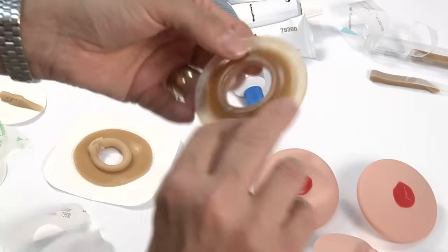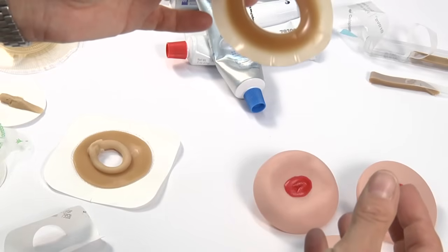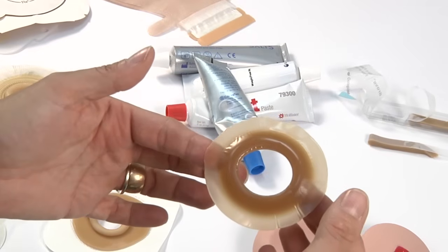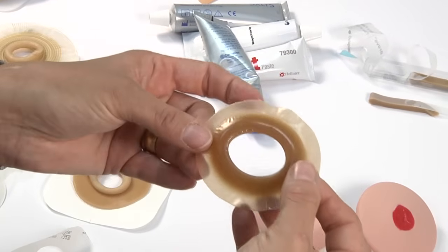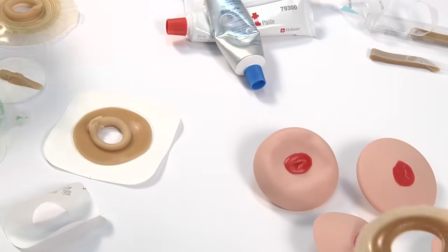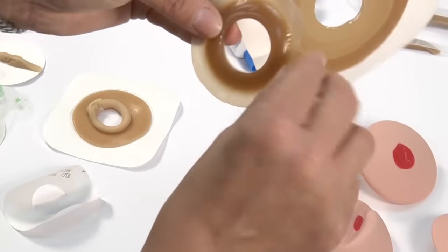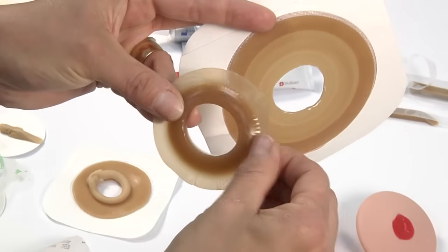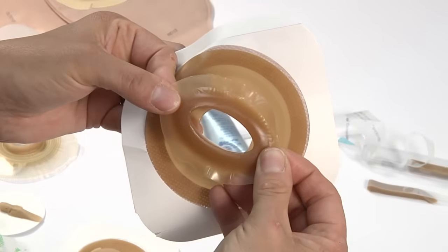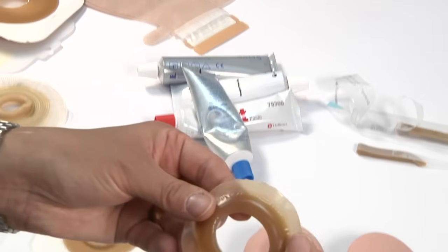And when you manipulate these ones, you're going to notice quite a bit of difference from the other barriers in that they have a lot of memory. So when we stretch it out to that shape, it doesn't take very long and it wants to actually go back to its original shape. So that can be a little bit of a challenge when you're trying to teach somebody in terms of manipulating it. If they have their barrier and they're wanting to put it on the back of a flange, you really have to be quite careful and quick that you stretch it out and place it onto the back of the flange at the same time. And that may be a little bit more of a skill set than somebody feels comfortable doing, okay?